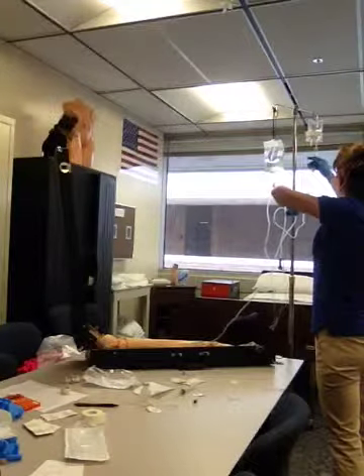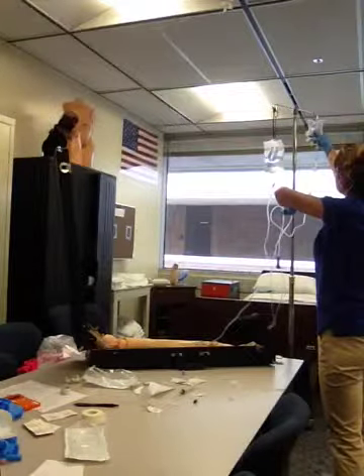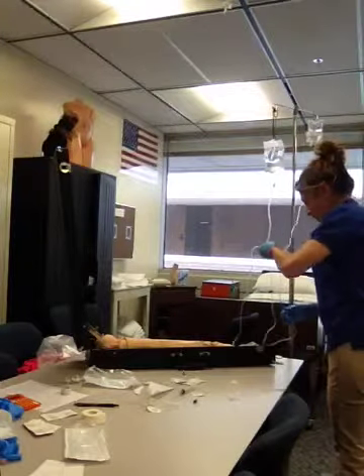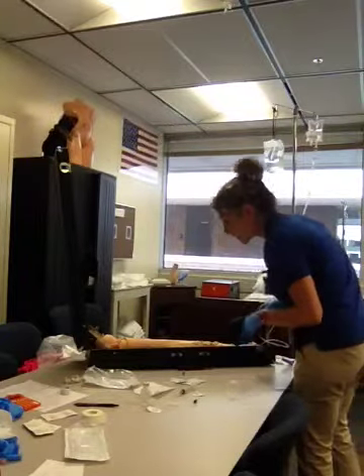Well, and we're going to count for 17 drops per minute. And good. And I'm going to make sure that we don't have any drainage at the IV site.